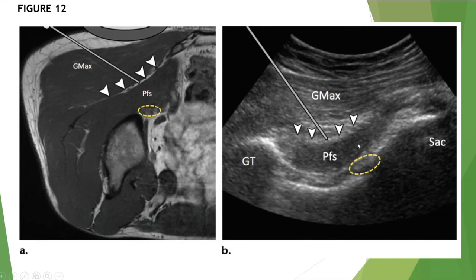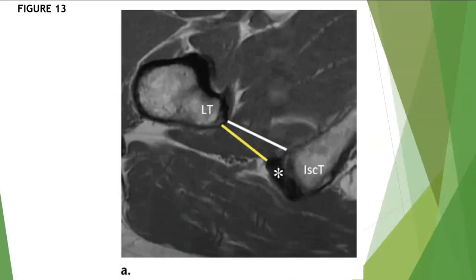So here you have an example of ischiofemoral impingement, ending our presentation just now. We have here an axial T1 MR image. This is showing a normal hip with the ischiofemoral space with a white line, and the quadratus femoris space by the yellow line.